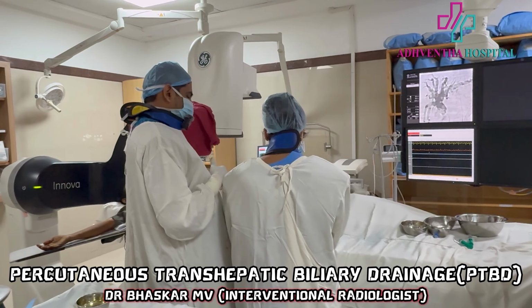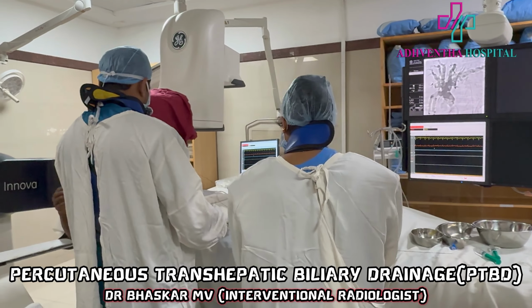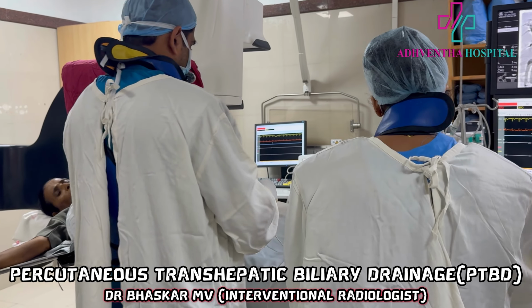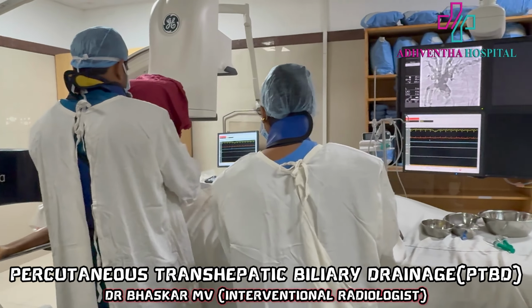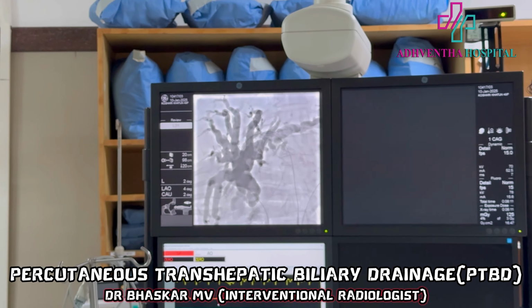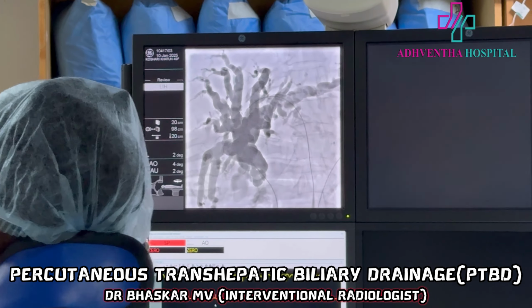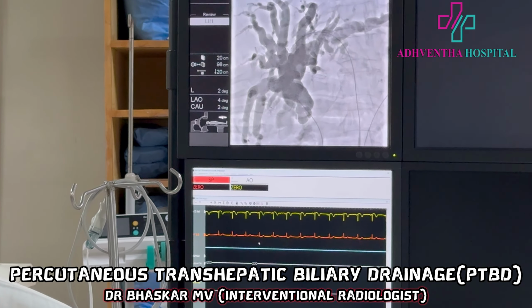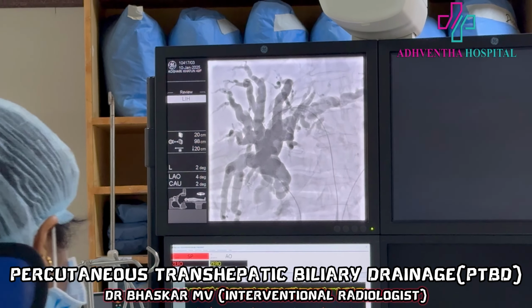Amma, does it hurt? A little. Keep your hand down. Patient will be able to communicate well without any pain, and comfortable, relieving the major problem of jaundice, enabling the patient's liver functions to be back to normal, as well as making the patient fit for the procedure, if at all they will be doing any major surgery.